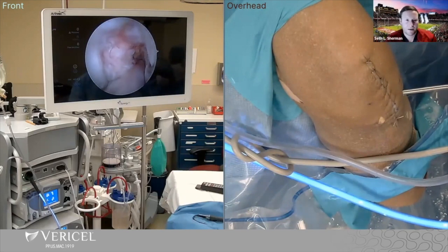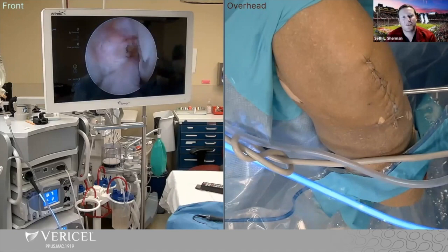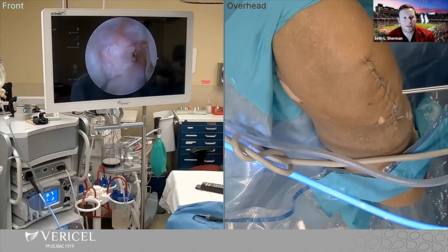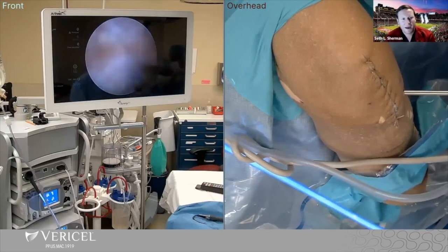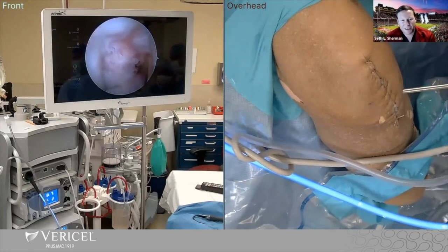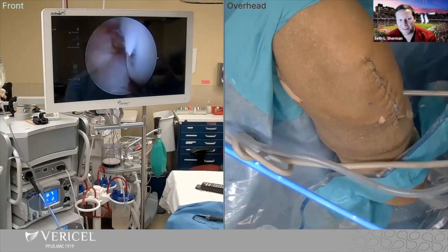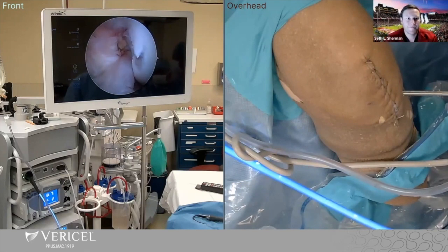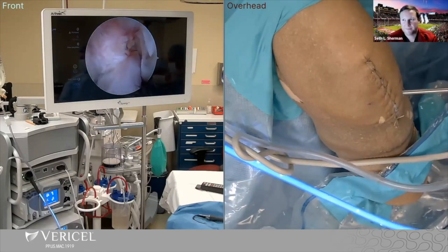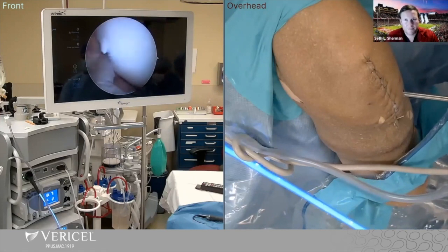I tend to use a curved gouge for these cases, but your technique is very straightforward and nicely demonstrated. I also like to show patients that the condyle is huge and we've taken so little of it — you can do a video or just a picture showing how little that biopsy site is and how non-consequential it is. We do notchplasties and other things for meniscus transplants where we're taking a little more than that just to get access. This is completely non-consequential, as you mentioned.